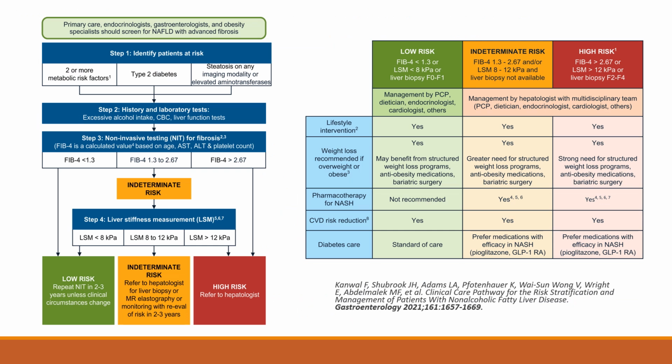So based, I'm sure, at least on some of the above, the ACG, the American College of Gastroenterology, first published a guidance document in 2021 recommending a FIB4-first approach to staging patients with MASLD or screening those at risk for it. For those with a FIB4 less than 1.3, continued monitoring and standard of care were recommended. And for those with an indeterminate FIB4, Fibroscan was recommended as the second step.